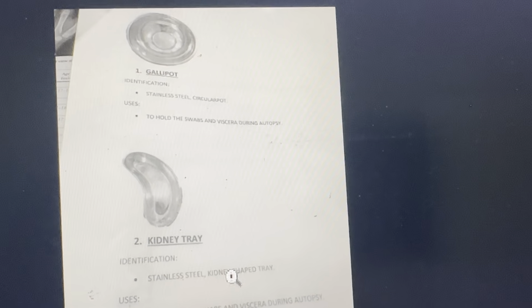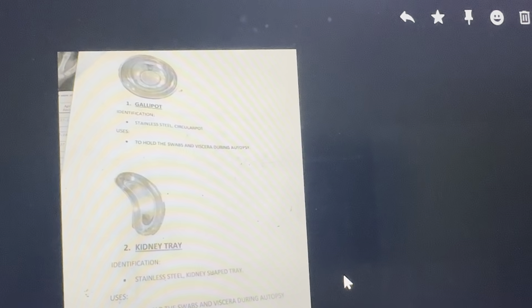Identification: stainless steel, circular pot to hold the swabs and viscera during autopsy. That kidney tray — stainless steel kidney tray to hold the swabs and viscera during autopsy.